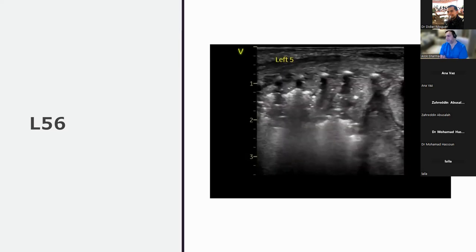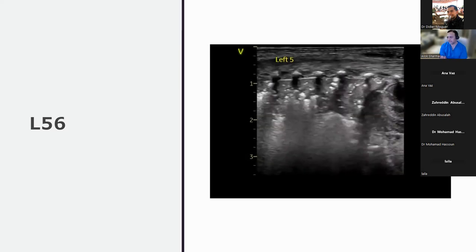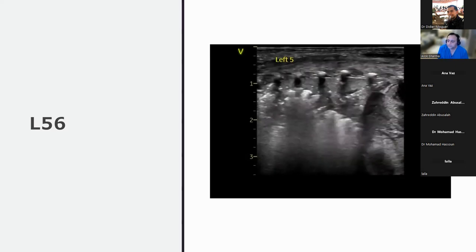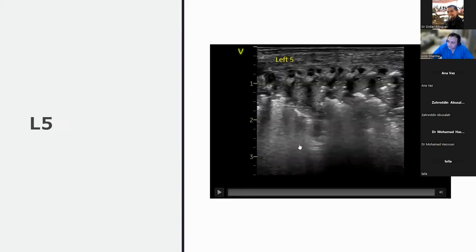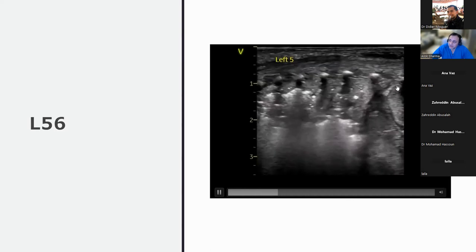Very good. So let's say we've made our minds up that usually the fives and sixes are the dependent area of the lung, but you've got the right and the left. Which is worse? Left. Yeah, left side is worse. So my experience usually says I will start with the worst side.